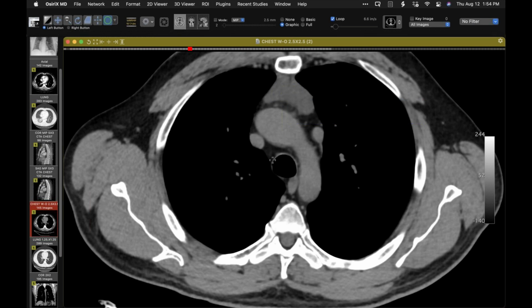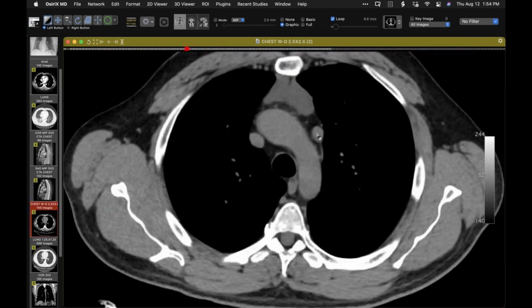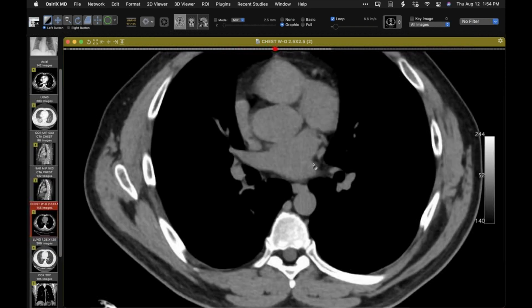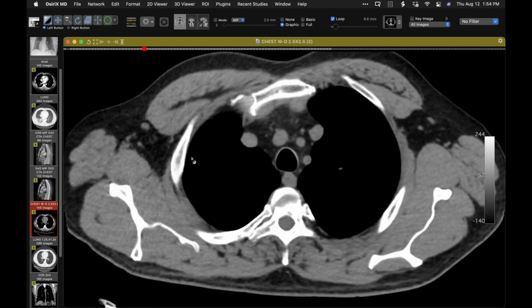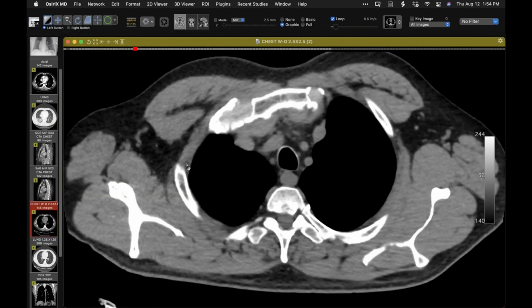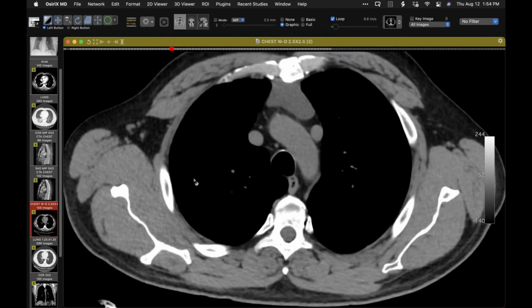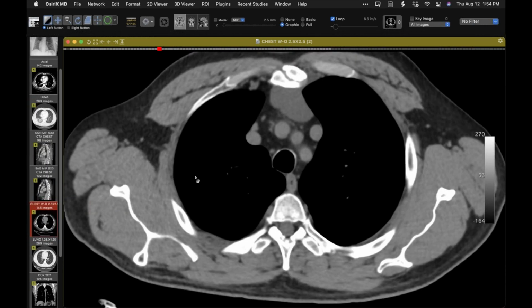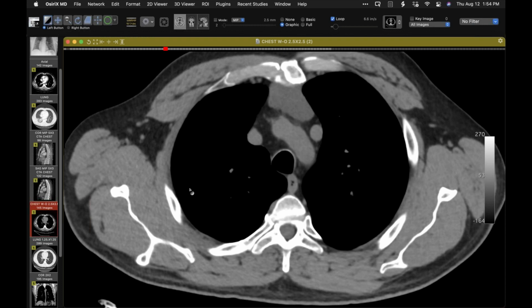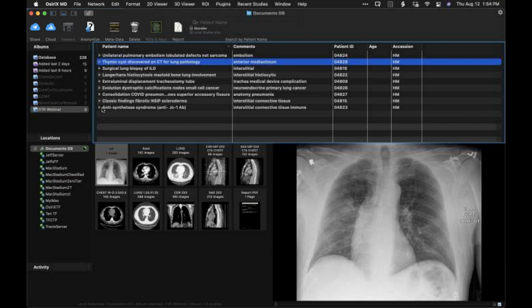For those of you that recognize I hesitated a moment, I can't remember if I saw it before, but this is obviously just a persistent left SVC that goes to the right place down there. Okay. Very nice one. Yeah, and there's no real brachiocephalic vein because you've got equal size vena cava. So we can argue it's a congenital thymic cyst. Interesting, huh? Okay, let me show you maybe one more.